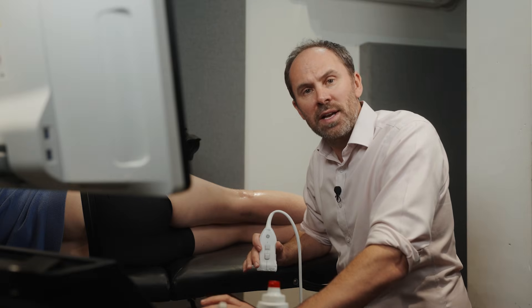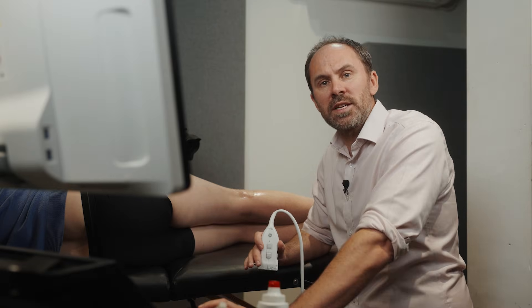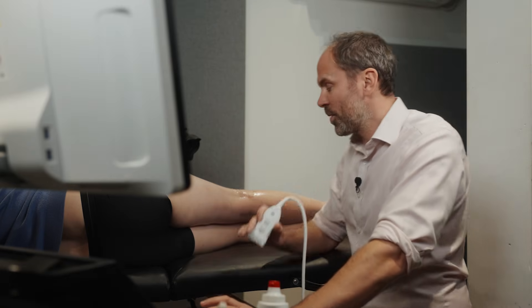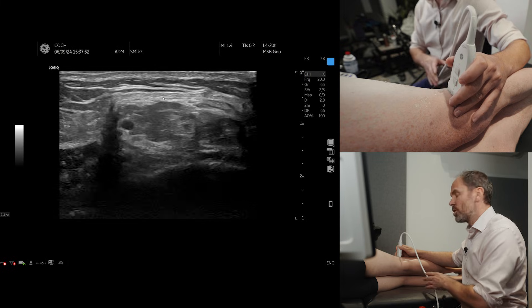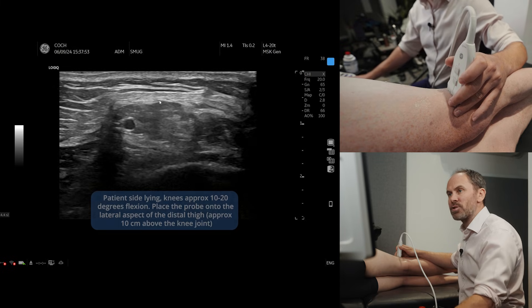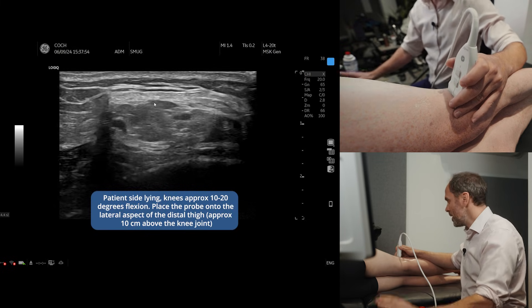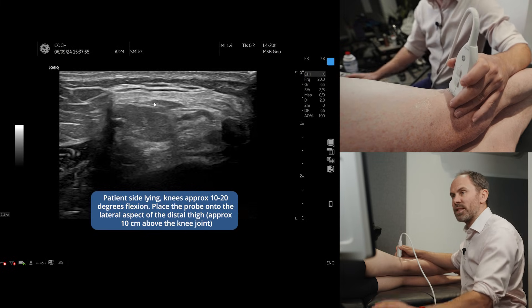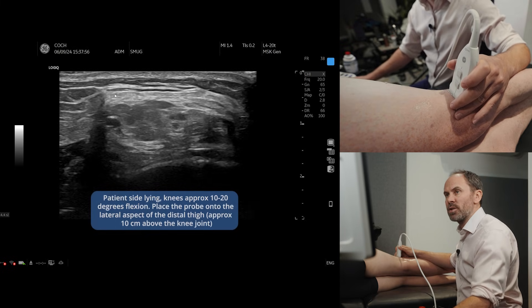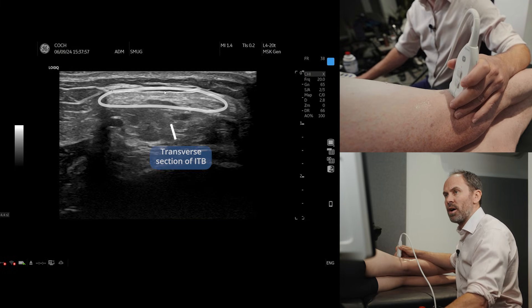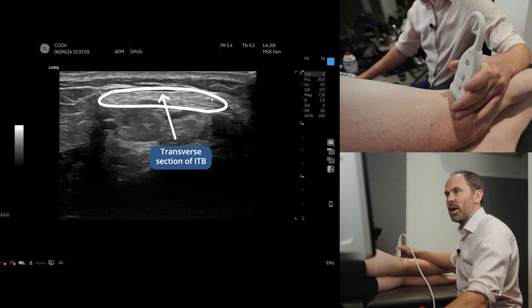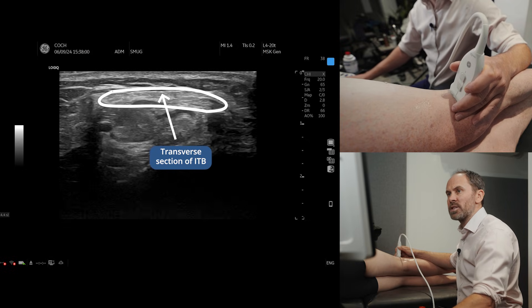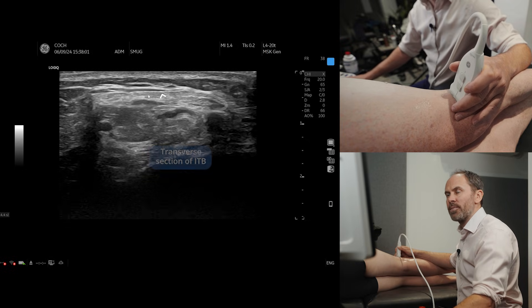I'm going to show you a dynamic ultrasound test to look for ITB problems. In runners particularly, you can scan the lateral aspect of the knee, place it in transverse section, and you can see this hyperechoic region here, which is the ITB.